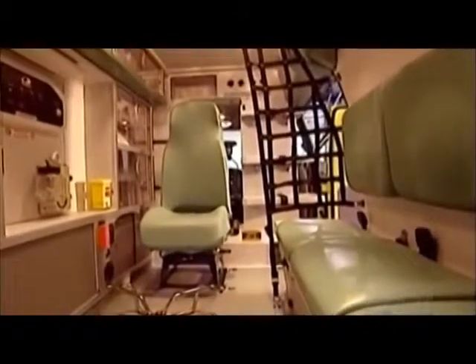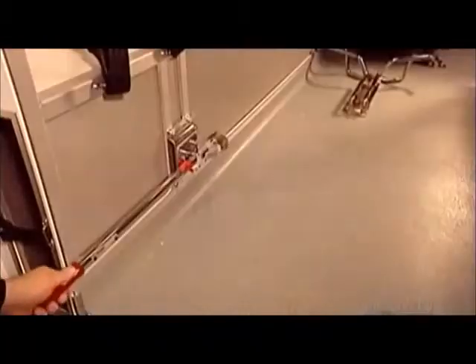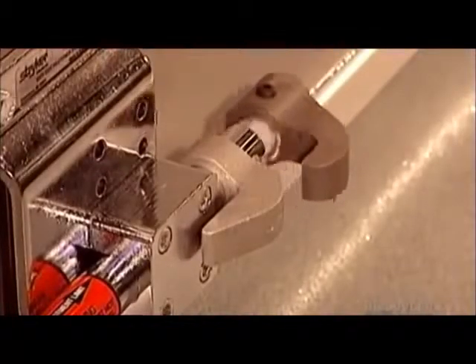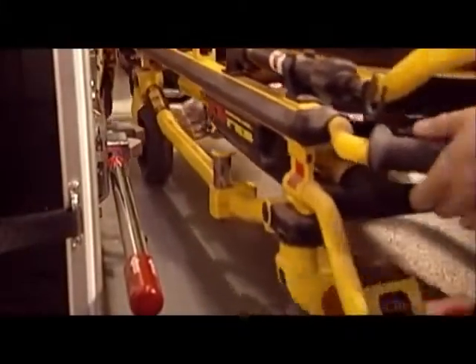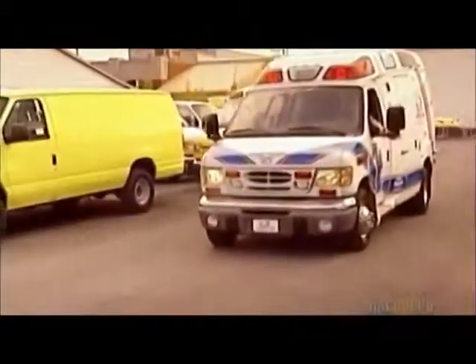A safety net by the 3-seater squad bench protects the crew should the ambulance come to a sudden stop. This mechanism holds the stretcher in place while the ambulance is moving. The stretcher simply locks in, keeping the patient safely immobile until the ambulance reaches the hospital.